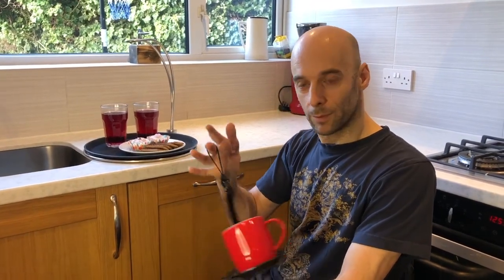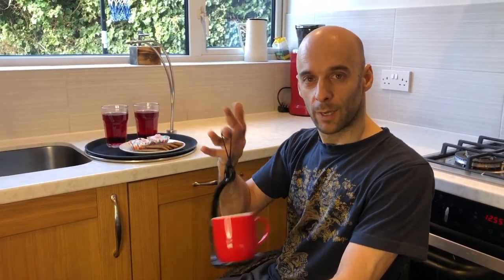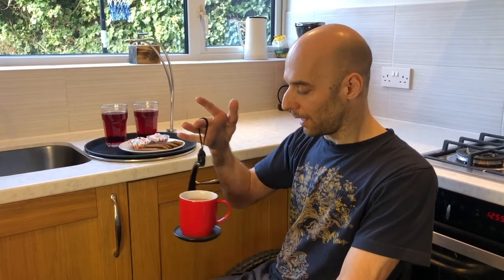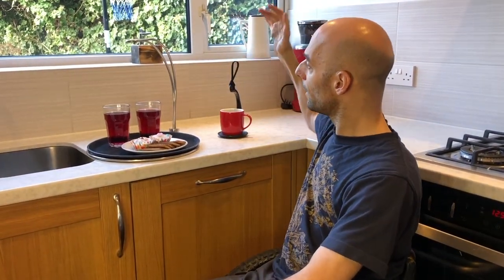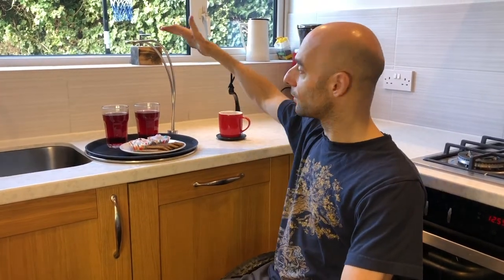So you may have seen our Spill Knot before, perfect for carrying your tea from where you made it to where you want to drink it. Great for wheelchair users and that's a really good product, it's been selling very well. So now we've got the Big Brother — this is called the Tipsy Tray.